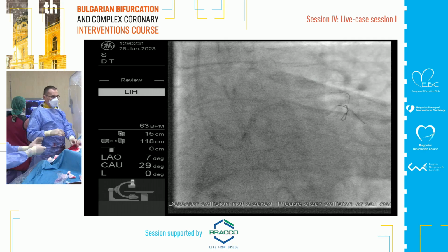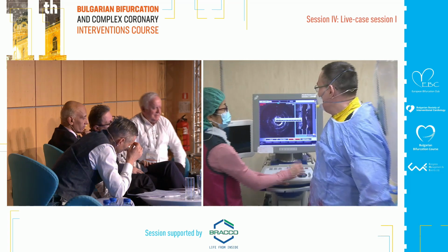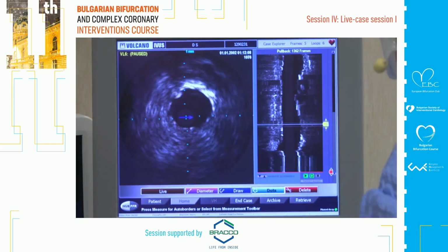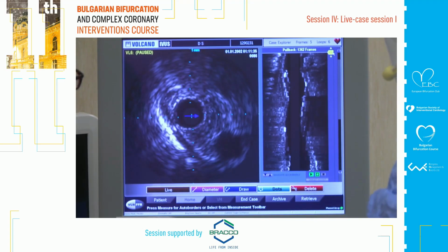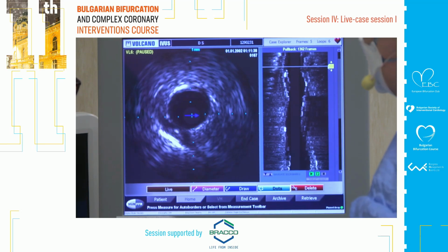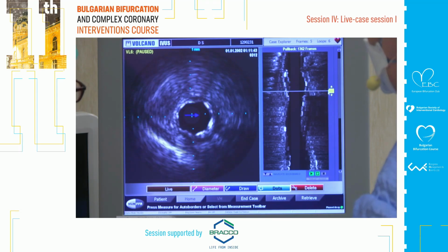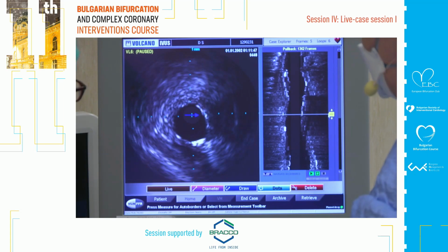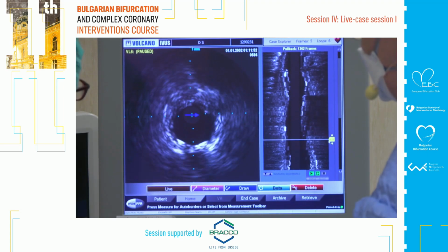And Akiko, can you describe the IVUS as it is now? Okay, let's start super quickly. Actually, it's much better than before. So this is a very distal edge, and here is the stent. Then you see visually the stent was much better everywhere, looks larger to me compared to the last time. And they come back, everything is better, and now it's well expanded.